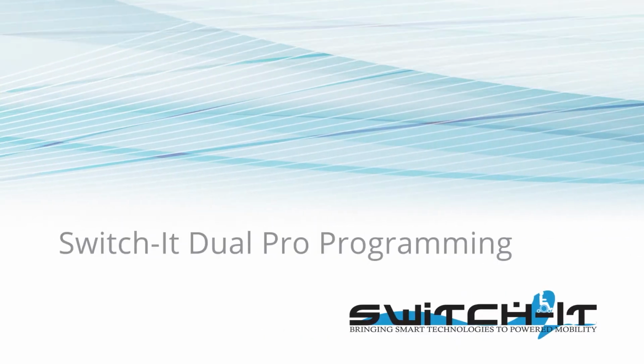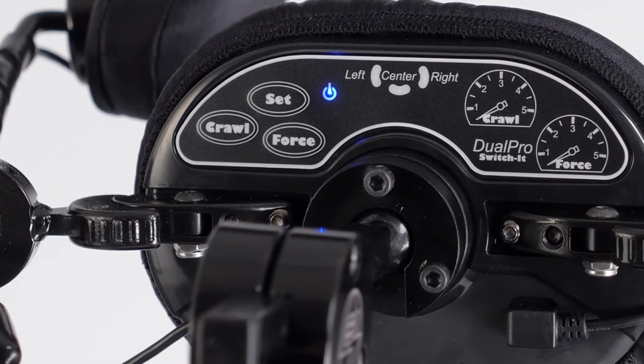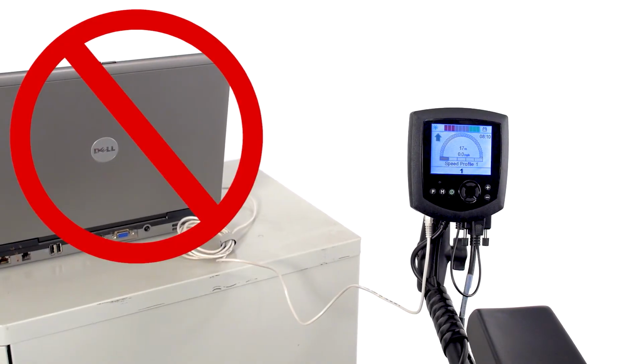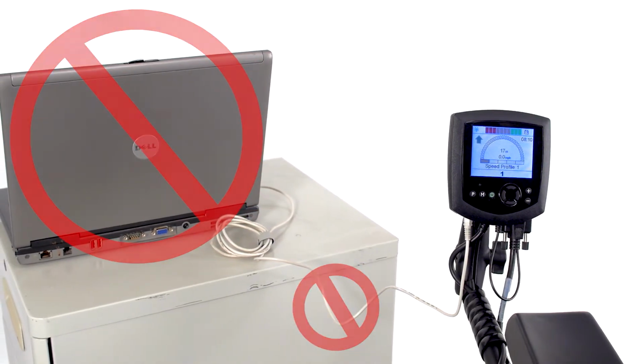Switch-It Dual Pro Programming. Programming the Dual Pro head array takes place entirely on the back side of the center back pad. There is no need for a computer, programming interface, or any type of programming software.